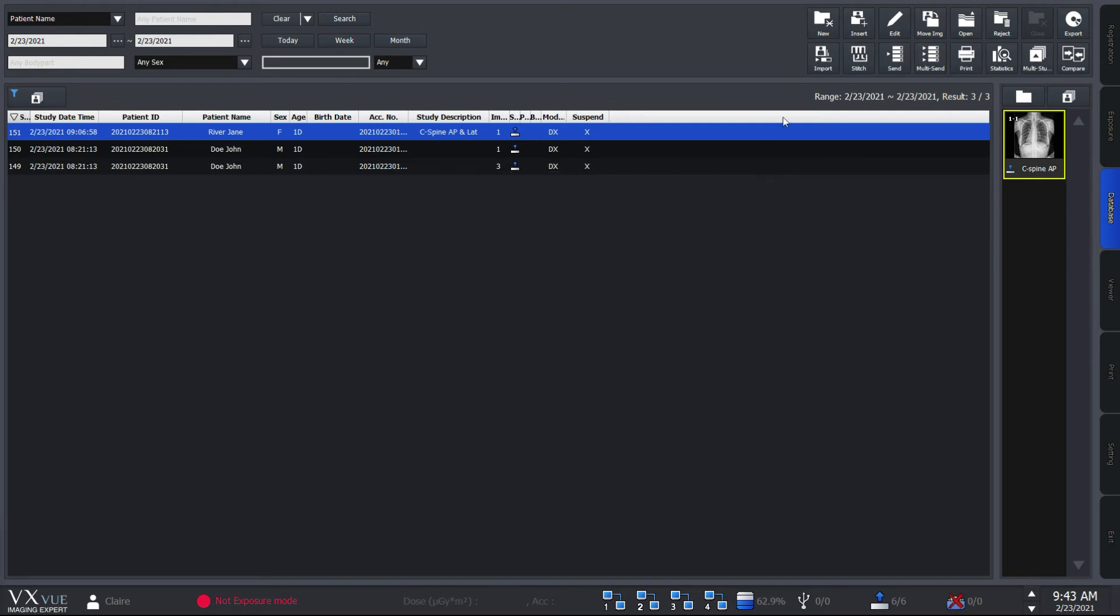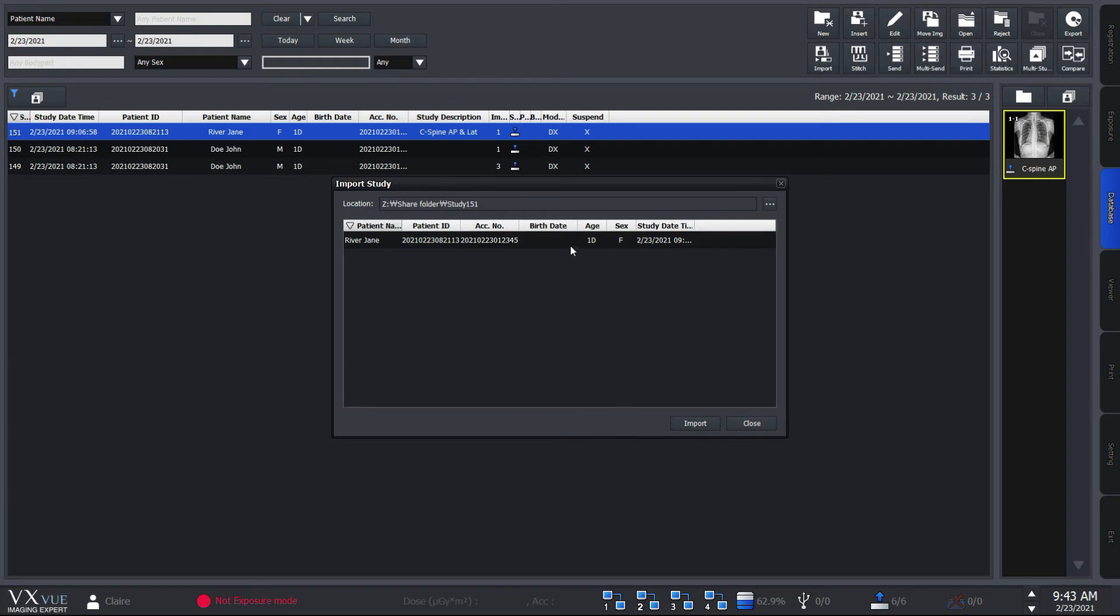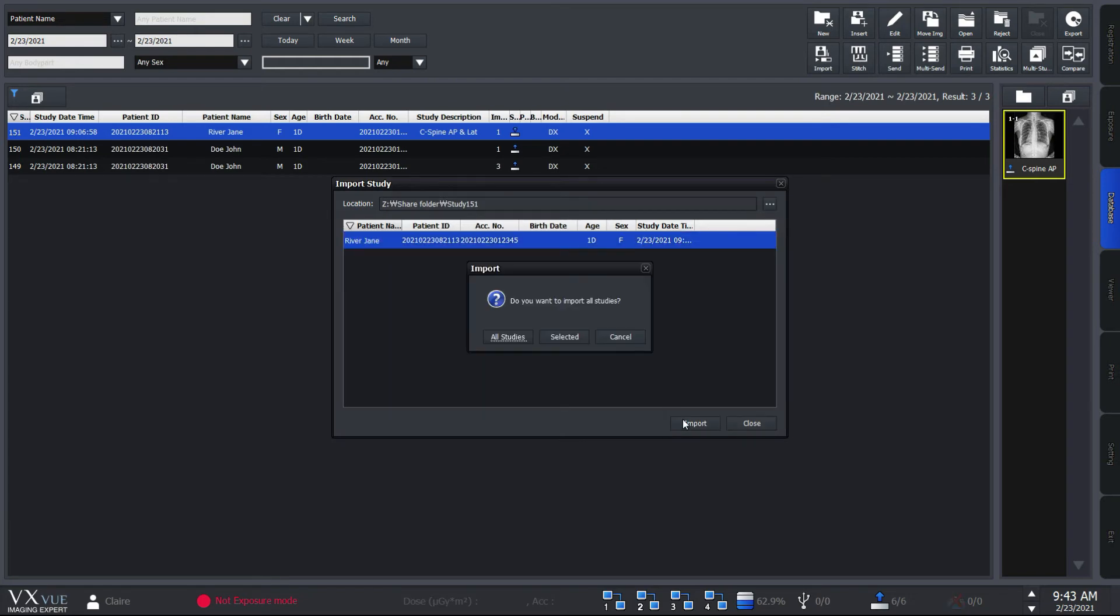VXView allows you to import exported study in IMG format if it's created with VXView.